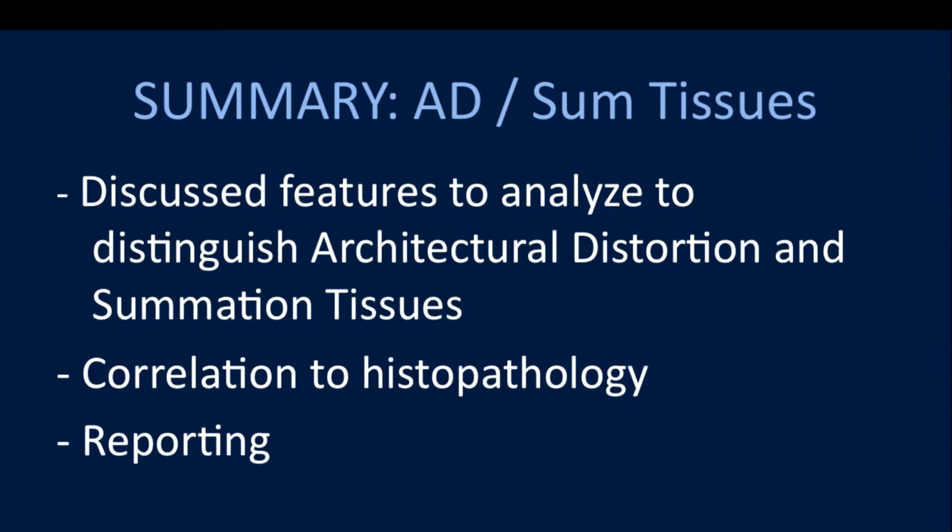So what I'm hearing is that at the time of the workup, you don't think it's distortion, but really what you're saying is that there's summation tissues. So the question is, if you have what you think is maybe a developing density, like now there's a new density there that was not there. No, it's not really distorted. It's just a focal asymmetry. Well, again, because it's really summation tissues. In other words, is it really?